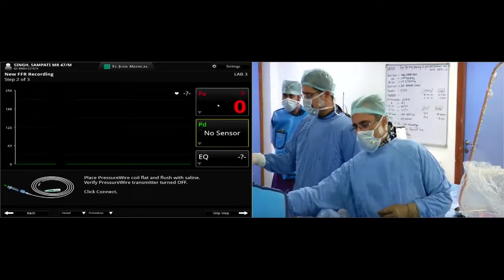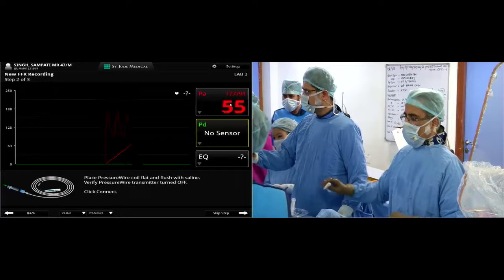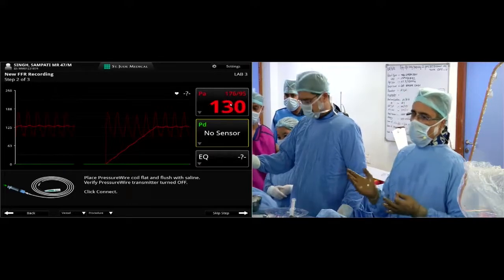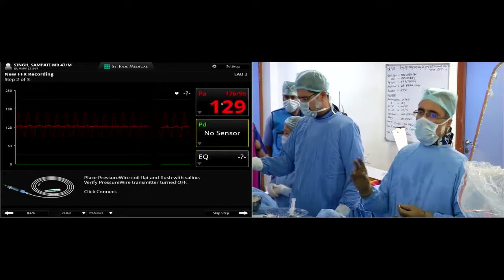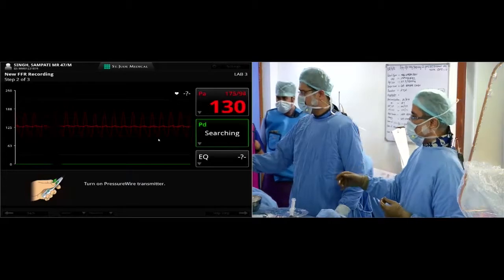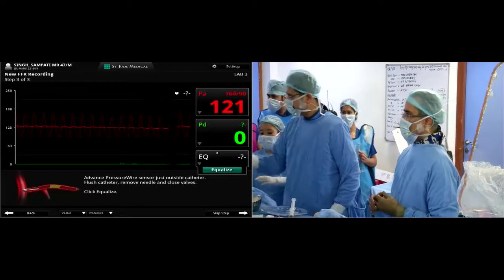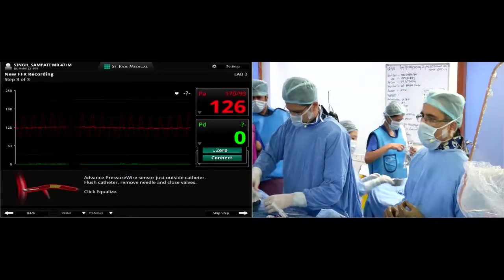Yeah, so I don't know. This discrepancy is commonly seen. What's your experience about it? Normally with an area of 6 millimeter square or lesser, obviously, there was some correlation between abnormal FFR and left main especially, but there are situations like this which are pretty unique. Visually it looks like 30-40%, not more. Area comes out to be 4.9. So let's see the FFR. Even I think that it should be negative.